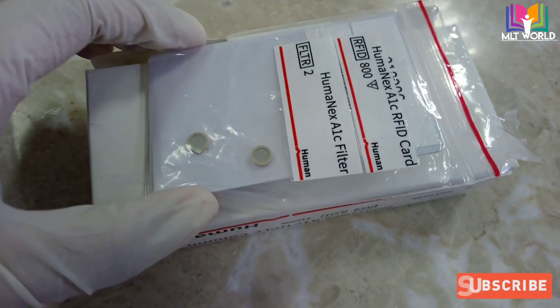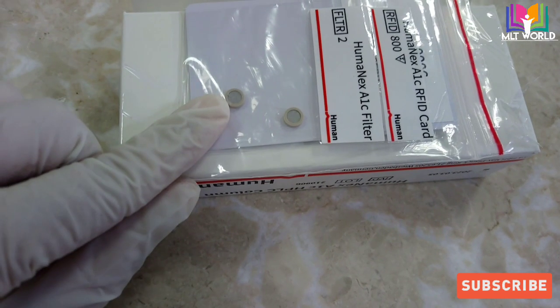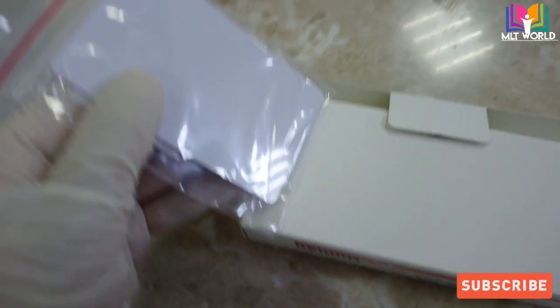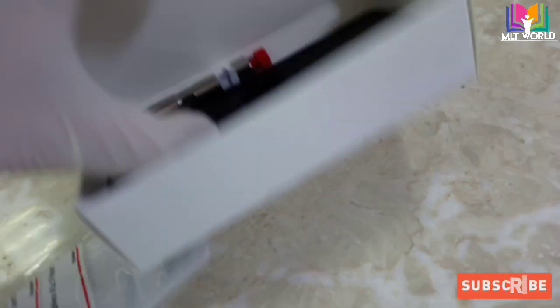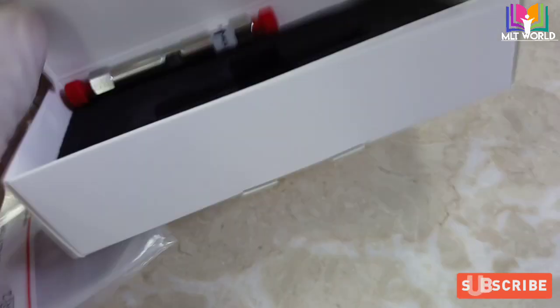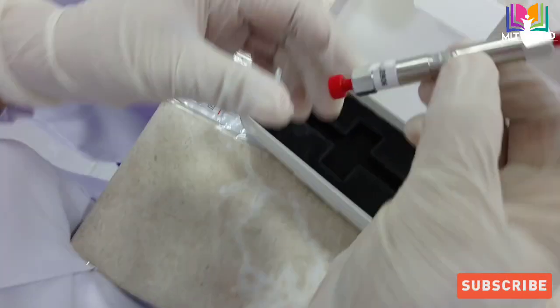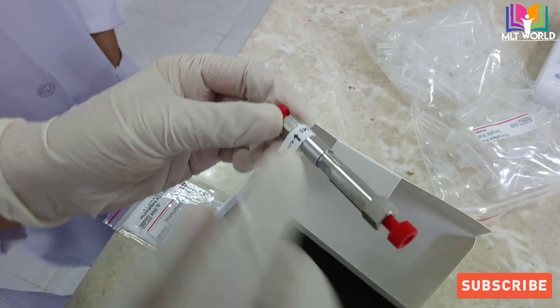Welcome back. Today in this video I will show you how to change the column and filter for the HumaxA1 analyzer. These two are filters, and there is an RF card that comes with the new kit. Normally in the HBA1C HumaxA1 analyzer we can run 800 tests, and when 800 tests are complete we have to change the RF card, column, and filter.